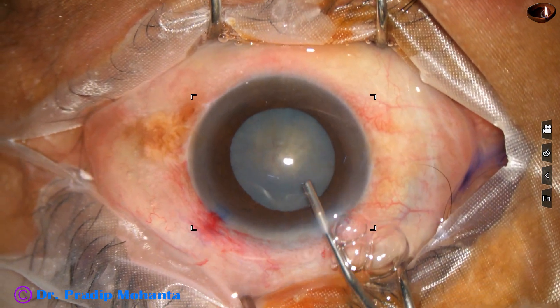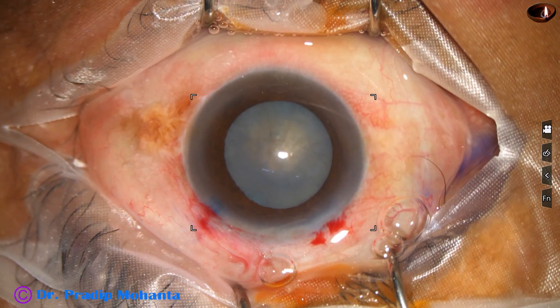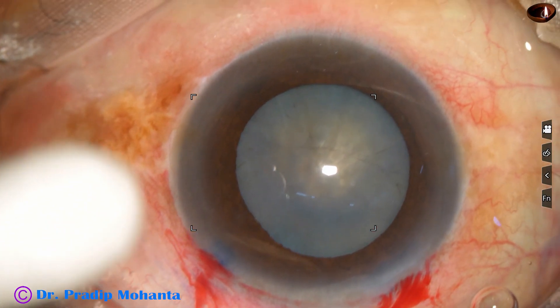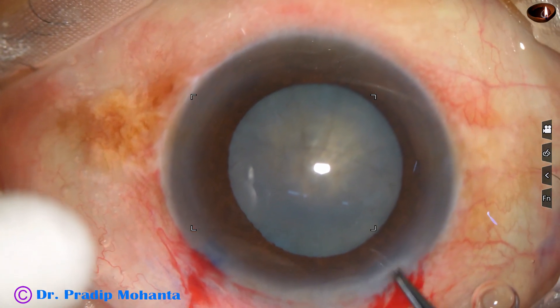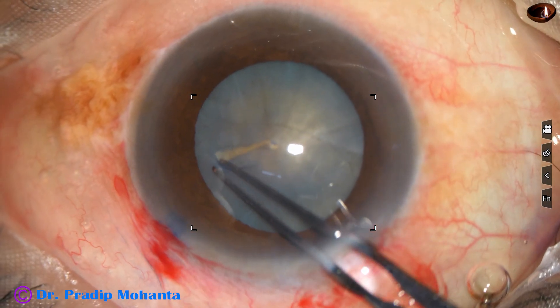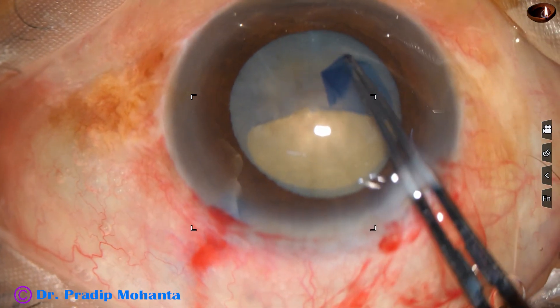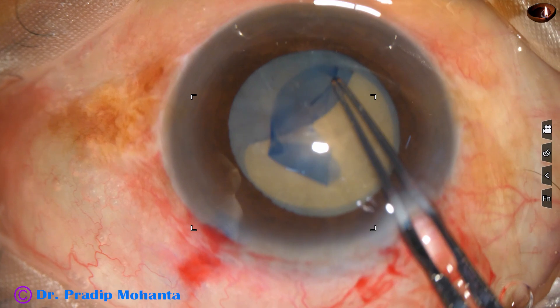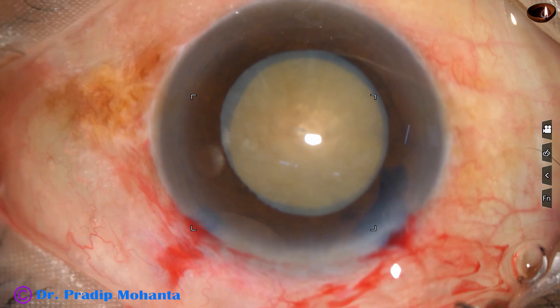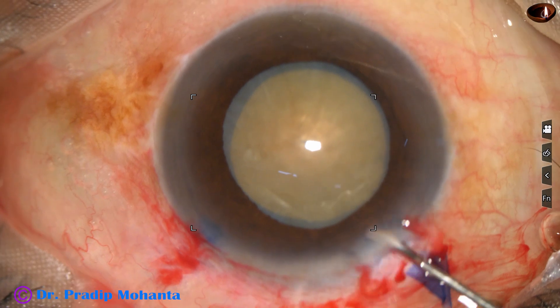The anterior chamber is filled up with this visco and now capsulorhexis is to be done. I use a utrata forceps, pierce the center, go to three o'clock, hold on side and do a rhexis. The pupil is mid-dilated and getting an adequate sized rhexis. The size of this rhexis is about 5.75 millimeter.